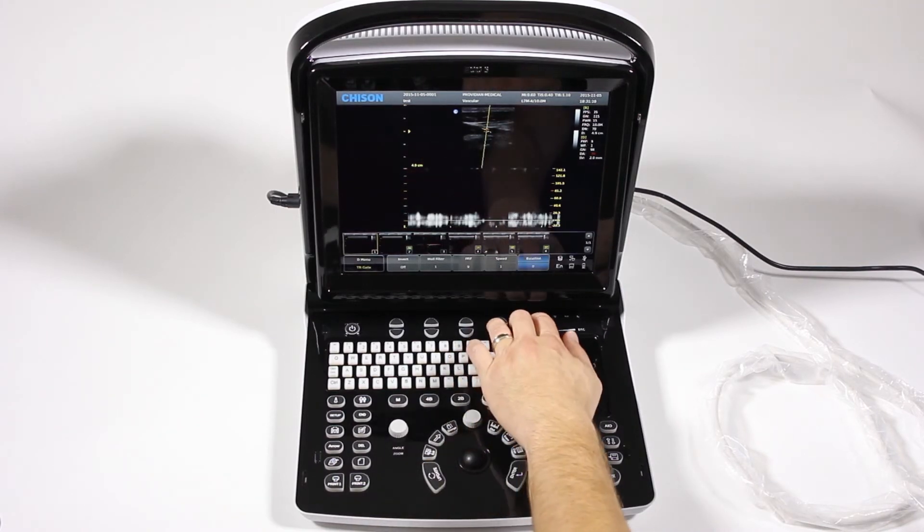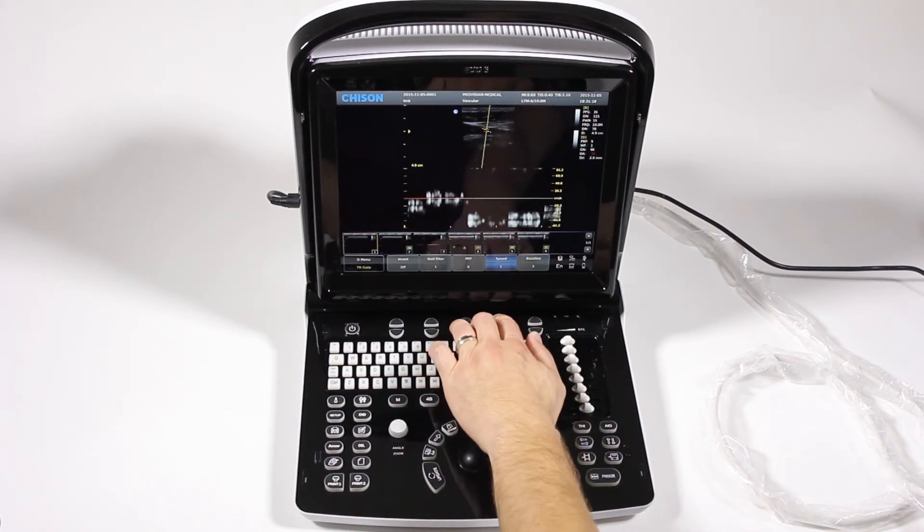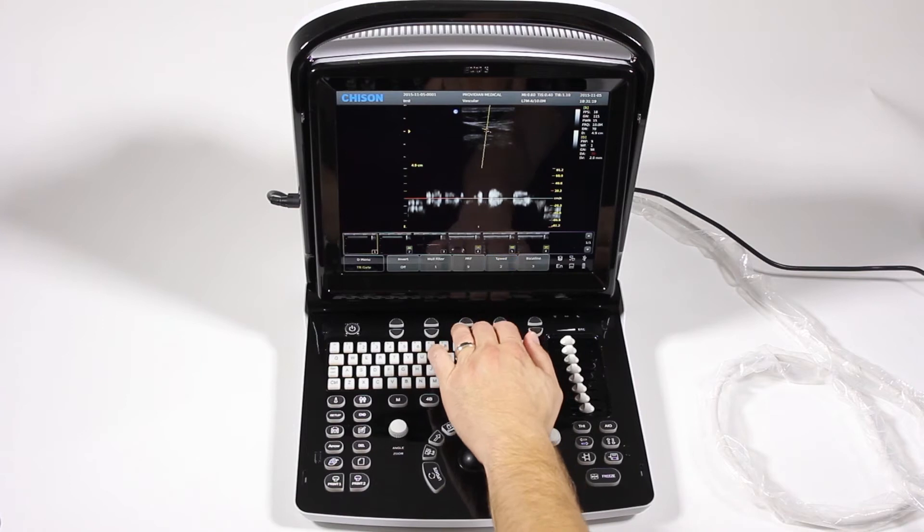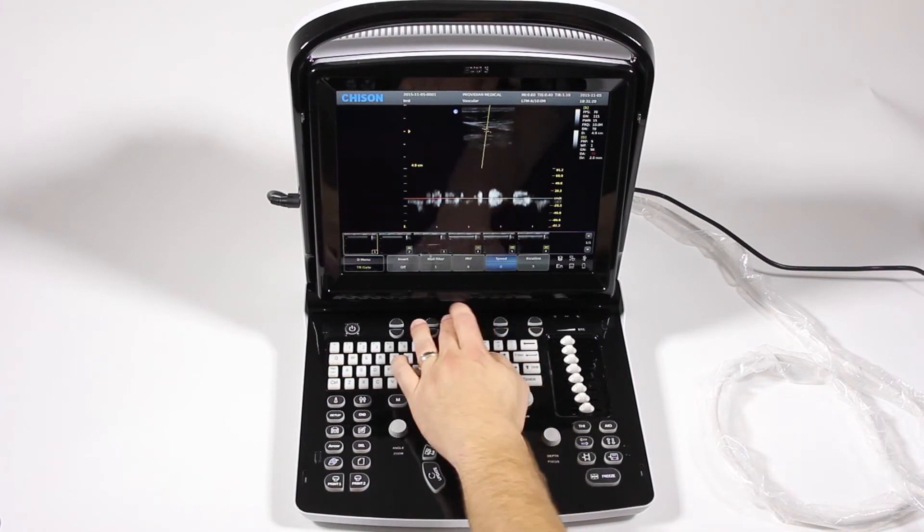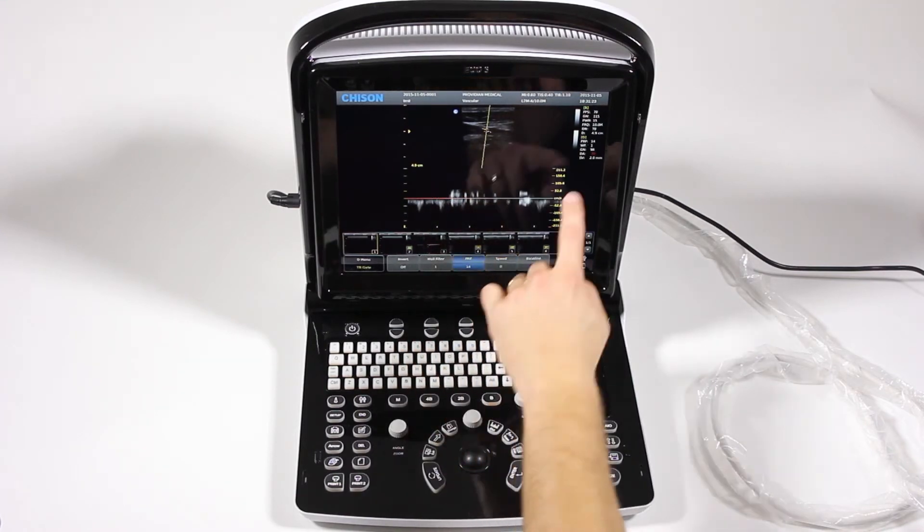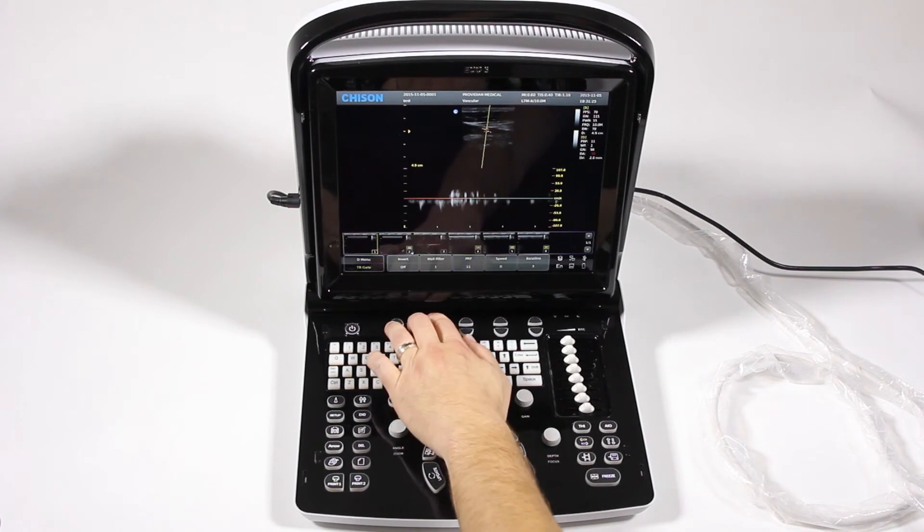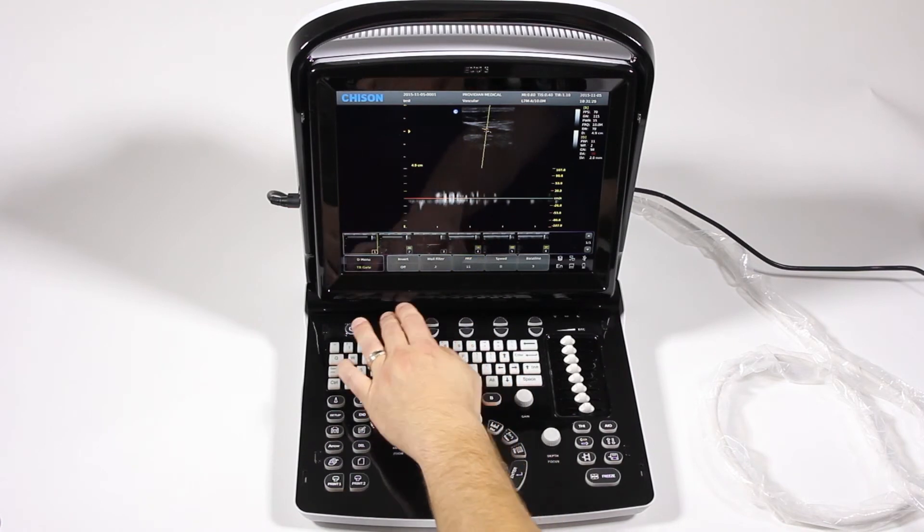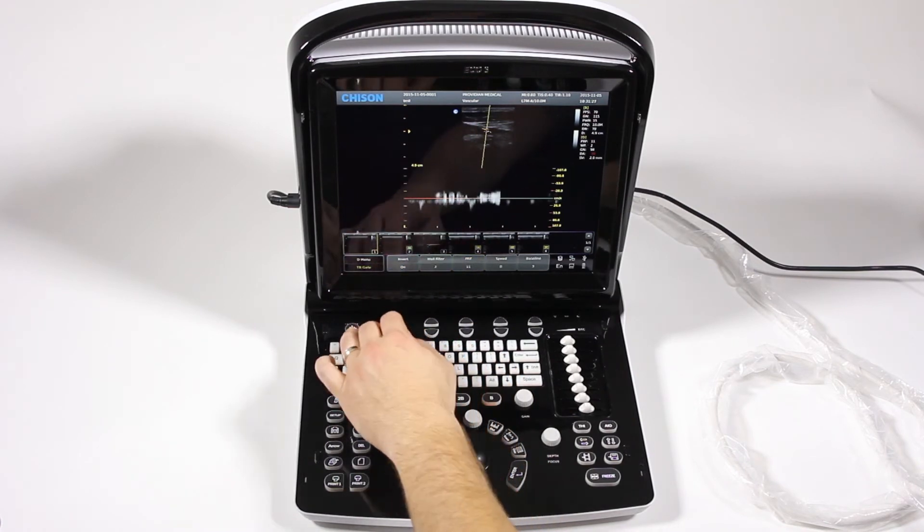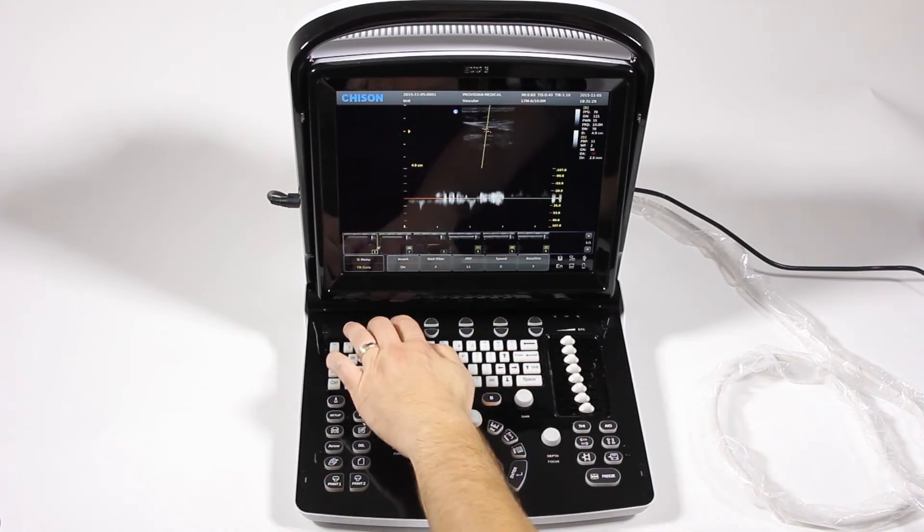Here you have your baseline, where you can adjust your baseline. The sweep speed, PRF, your pulse repetition frequency. I'll change the scale there. Your wall filter, if you want to invert it, flips upside down.